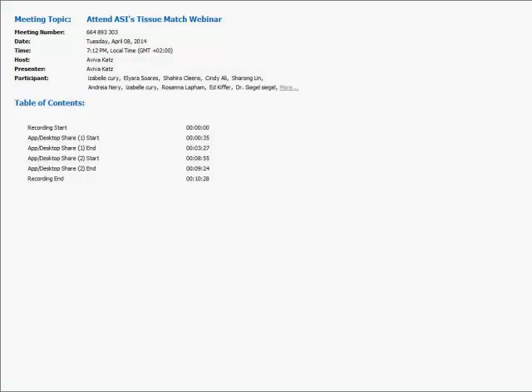The next question, Gabe, is the tissue match FDA approved or cleared? No, we aren't seeking FDA clearance for tissue match, as it doesn't do any clinical analysis. However, our fish is FDA cleared for a number of applications, including HER2 and ALK.